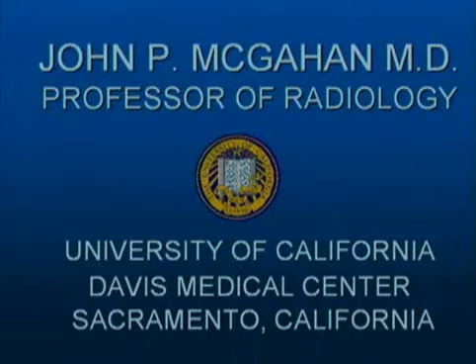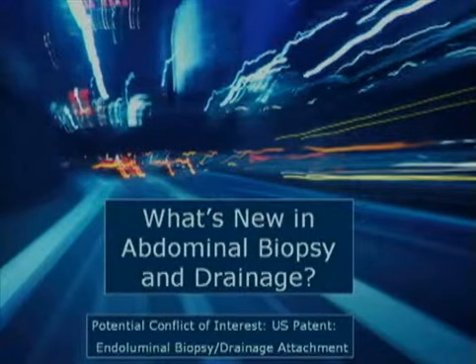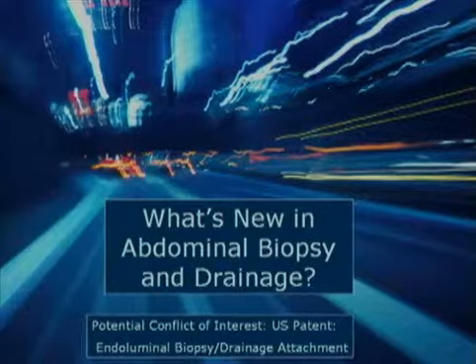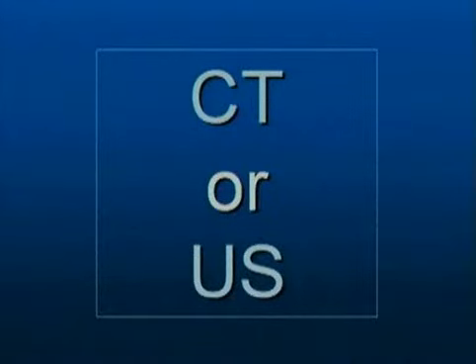Like to get started today. I'm going to talk to you about what's new in abdominal biopsy, and because of time, I'm not going to talk about new drainage techniques. Well, first choice we always have when we're doing a biopsy is do we do it under CT, do we do it under ultrasound? Well, there's certainly lots of ways of doing things, and I like this slide here.